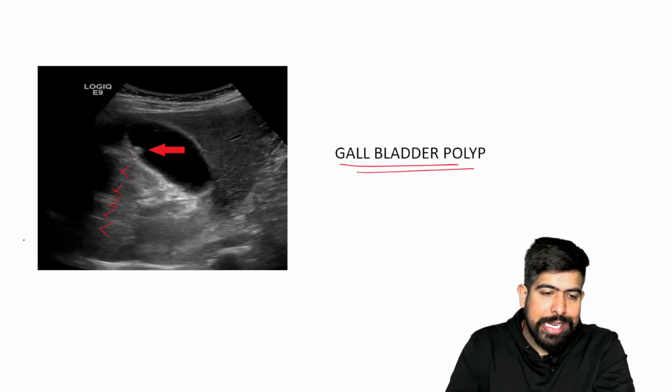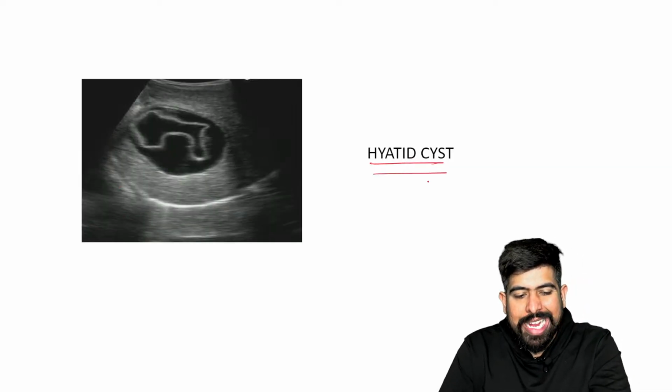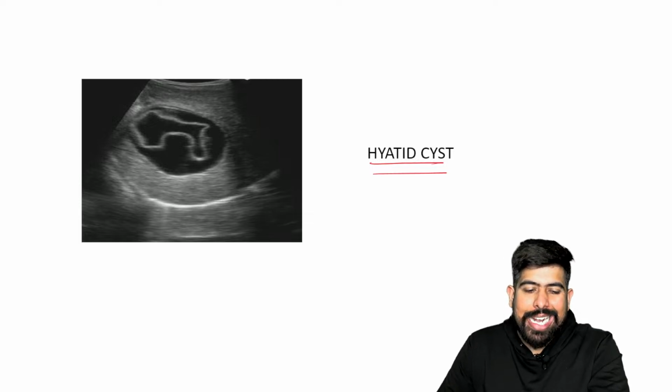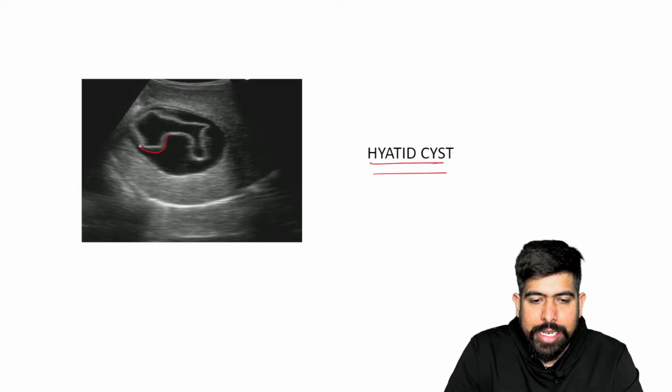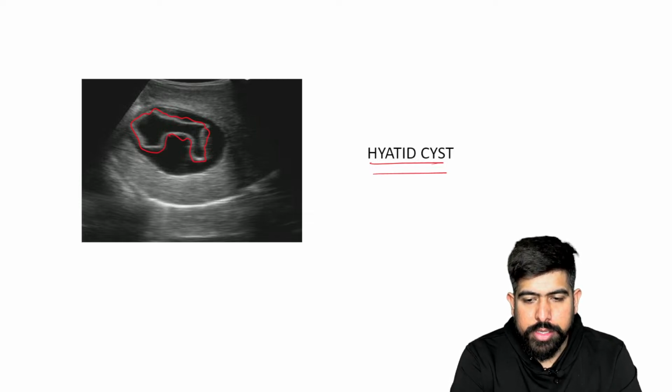Moving forward to the next image, this is the classical image of your hydatid cyst. Can you name the sign of the hydatid cyst? Can you name the radiological sign of hydatid cyst? Waiting for your answers.